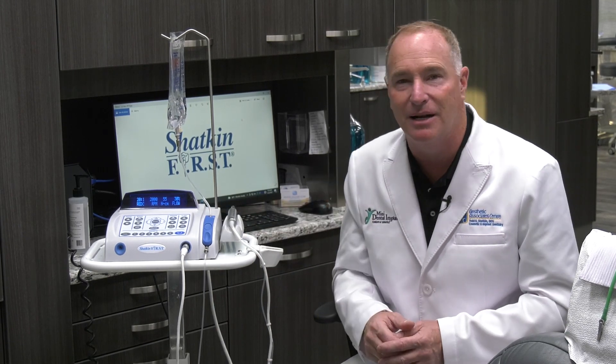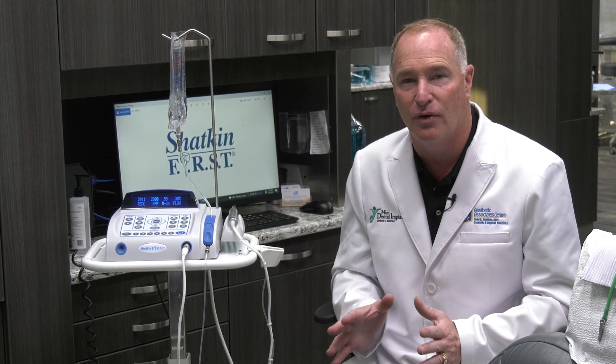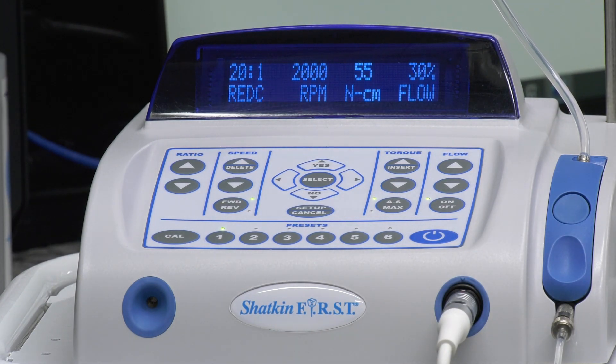What's great about it is Aseptico has pre-programmed the motor for the Shatkin First technique. The first setting at number one is called the pilot drill setting. The pilot drill is placed in the bone at 2,000 RPMs, 55 newton centimeters, with 30 percent water flow.